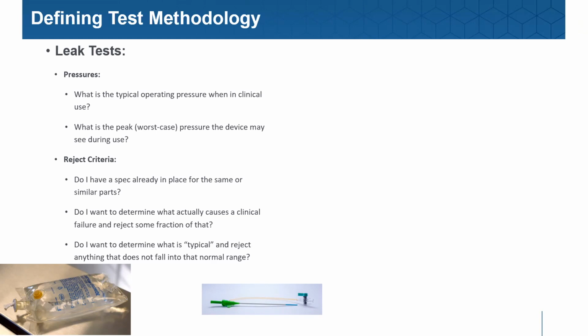Precisely. And what that comes from, as opposed to a flow rate, is the automotive industry, which is much more mature as it relates to establishing reject criteria for leak applications. They always use a flow. Typically, most commonly, exactly right. 95% of the time, they use a flow rate. And for the automotive industry, it makes perfect sense for one reason.